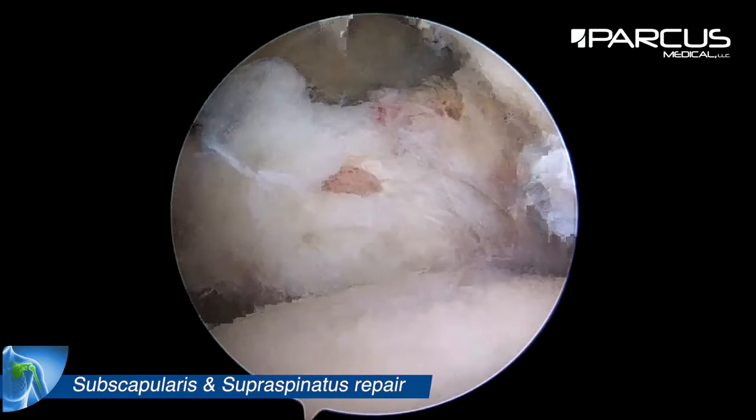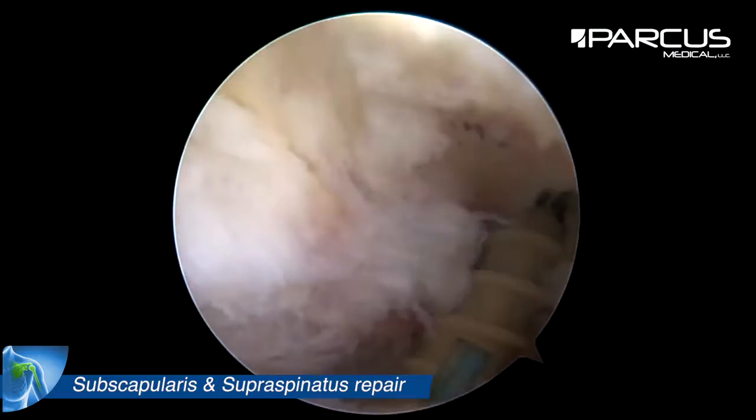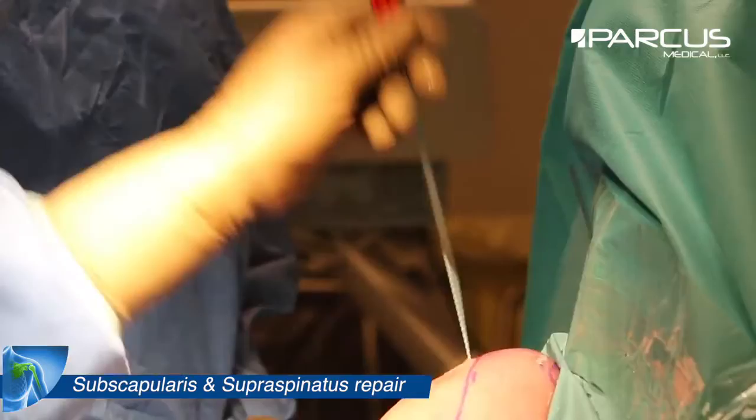Then we need to debride the lesser tuberosity with a burr and then we insert a screwing anchor just close to the cartilage on the lesser tuberosity.